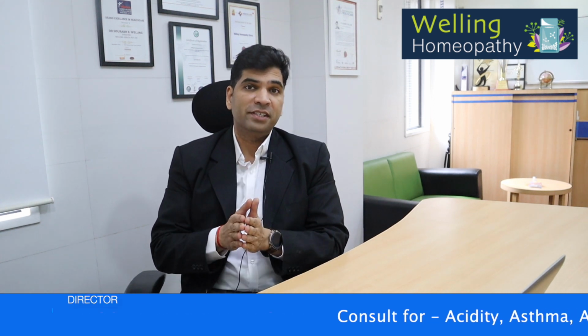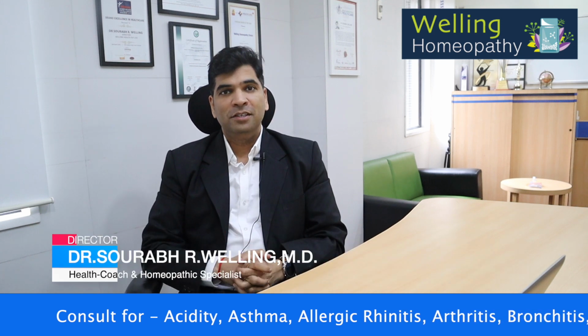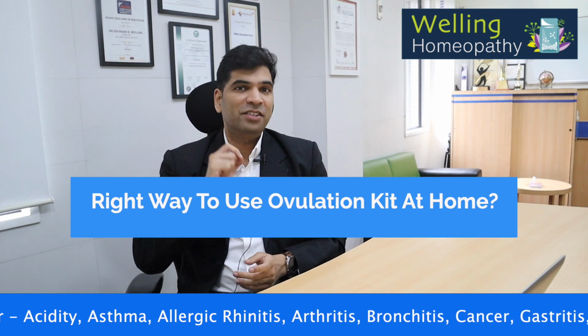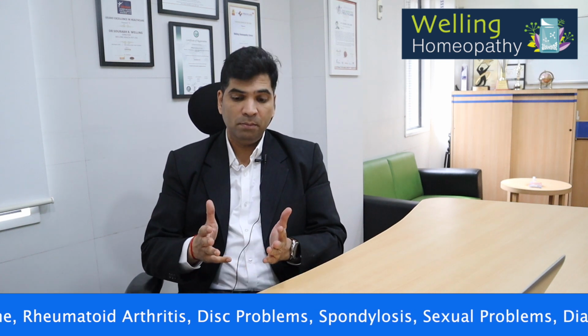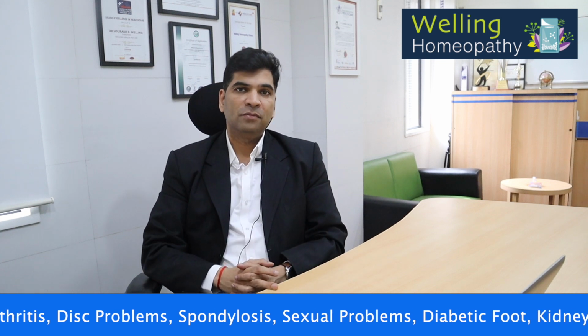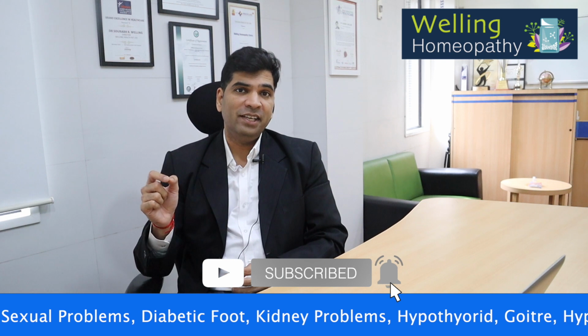Hi, ovulation test strips are urine tests that can be used at home to detect ovulation. These work by detecting the luteinizing hormone, which increases to prompt the release of the egg during ovulation. Sometimes they are called ovulation predictor kits or simply ovulation tests. If you are trying to conceive, checking your ovulation day can help you in better planning.